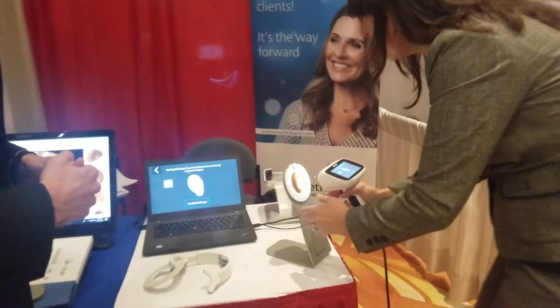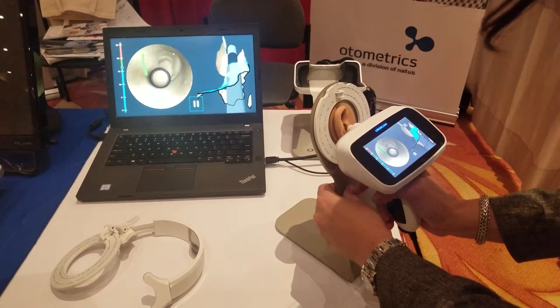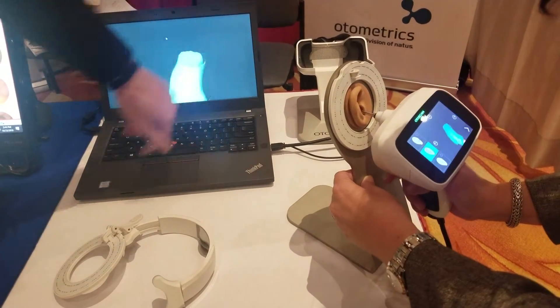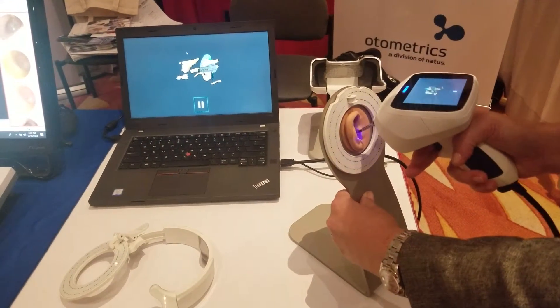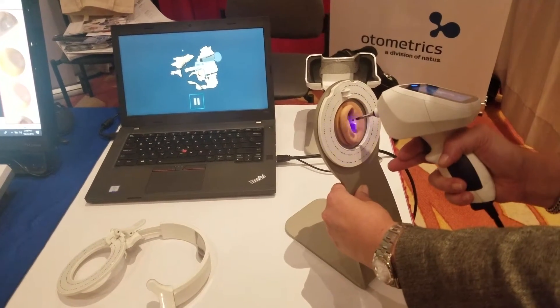We go 4 to 6 millimeters deeper than a silicone impression, way deeper and with less discomfort. And 4 to 6 millimeters is actually a big difference when we're talking about doing an ear mold impression. So here's the demo. I'm going to go into the canal and scan it. I've got green — the green area is the target area. Then I'm going to come out and scan the top of the canal. Now we're going to scan the outside of the ear using the line laser — the same type of laser you see in a grocery store for scanning barcodes.